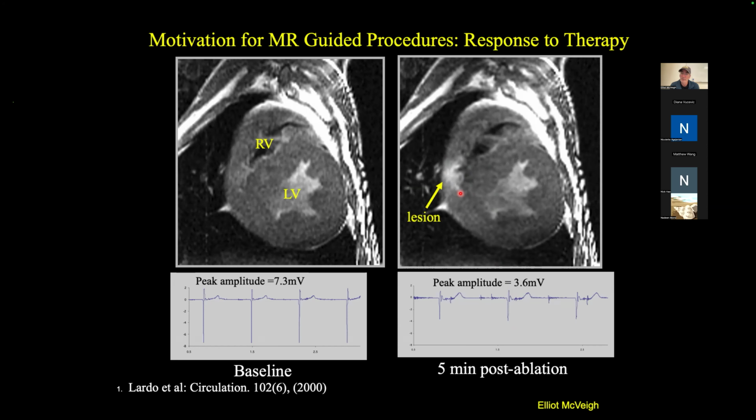So we thought it was an exceptionally promising technology. We worked on it for many years. However, it really didn't take off commercially. It's a big research topic, but commercially, putting MRI scanners into cardiology departments and asking cardiologists to do MRI-guided electrophysiology, it was only for the upper elite EP docs who really wanted to go to the trouble of doing that.